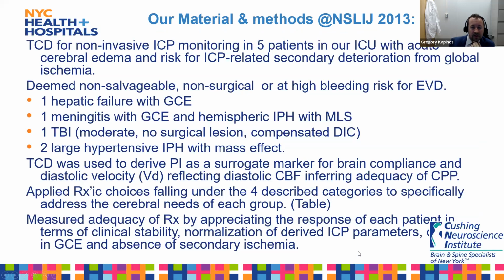We did that. I'm going to skip because it's very anecdotal, only a few patients. We did that without an ICP monitor on a few patients at North Shore in 2013. One had hepatic failure, coagulopathic. Nobody wanted to put an ICP monitor on them. So I used TCDs because of the global cerebral edema to guide our management. One had meningitis also, global cerebral edema, and an intraparenchymal hematoma. So the neurosurgery group did not want to put any probe in the brain. It was at risk of bleeding too much.